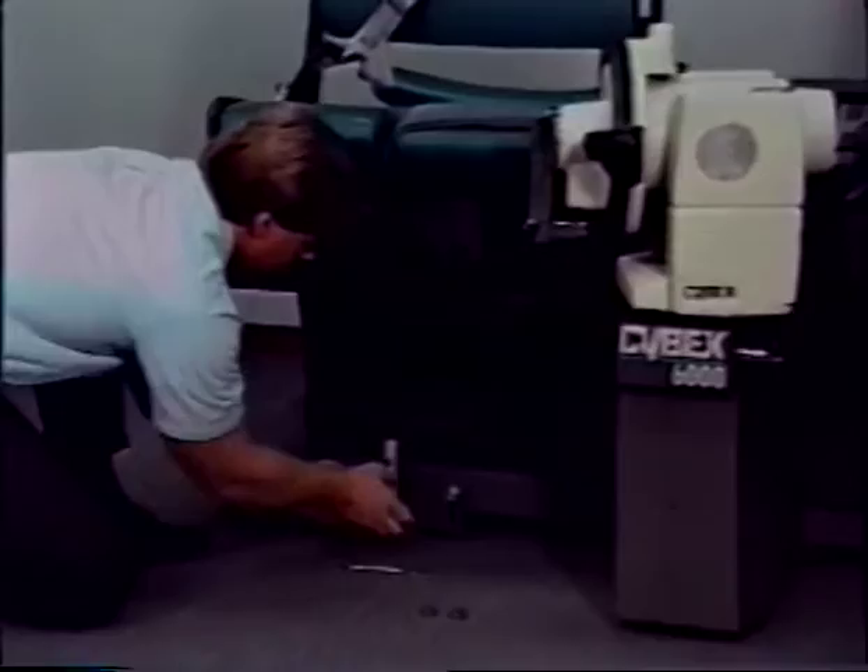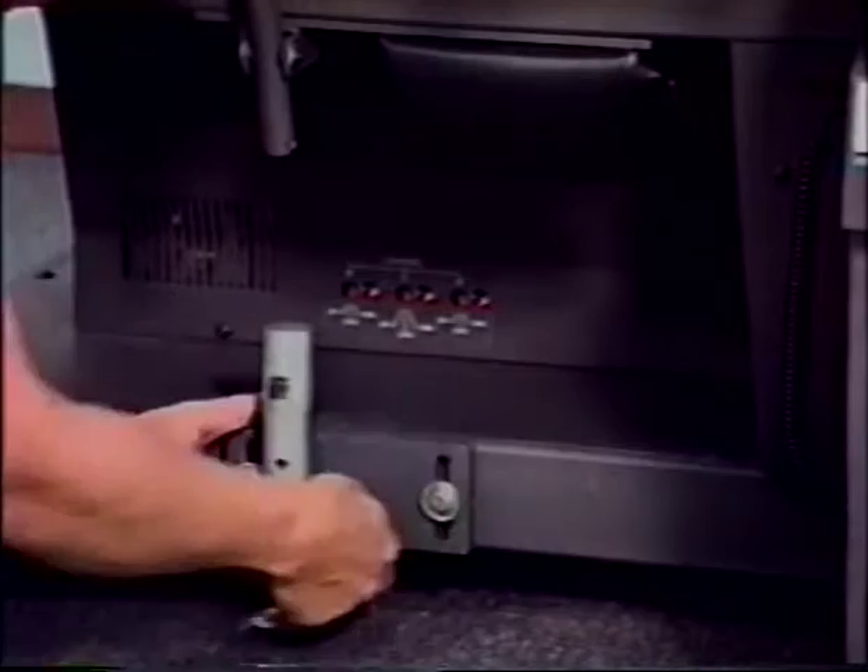Position the docking post so that the plate is even with the top edge of the base frame rail. With a half-inch wrench, snug the two screws so that the post is held in place but may still be moved.